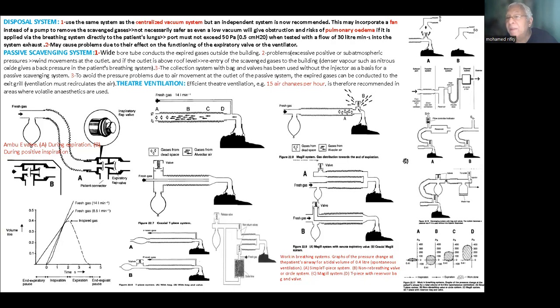This is the method where we use a tubing system on the mask of the patient to remove the exhaust of the patient. And we ought to have a special flow. This flow, of course, has a special rate to minimize the resistance and to assure that this flow is being properly dismissed from the department.